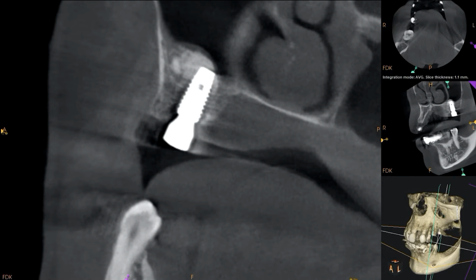Same thing, good bone on the buccal, great bone on the palate, and then it's pointed directly at our clinical crown down below, and the healing abutment's in place. So I really like this. Again, what a thoughtful, simple procedure for us as the clinicians, for the patient, to do that type of surgery to create that kind of impact in terms of the bone graft, immediate implants, one stage, and to do it in a timely fashion, I think is awesome for everyone involved. So really, really happy with the clinical result. Again, I couldn't be happier. So it looks really, really good.